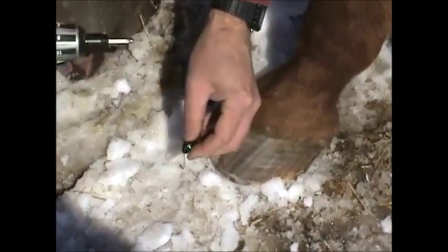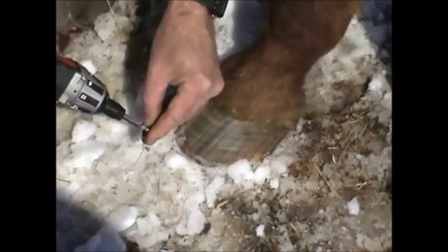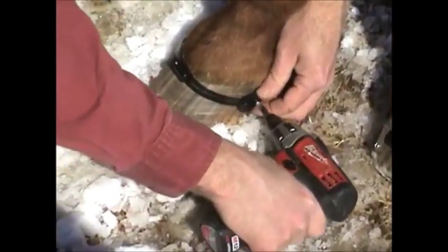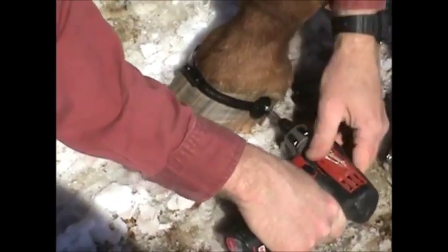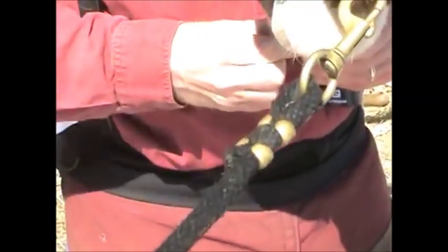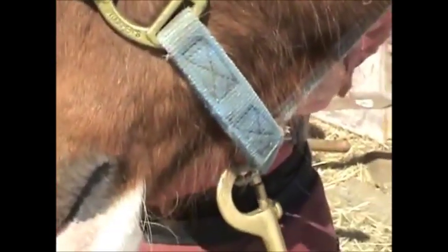Once you get the first two screws in, it goes a lot better. We'll sink this one and then do the placement, push it down where we want it, put the band on. Before they tighten — as the foot grows, it tightens itself. And these you tighten immediately on the spot. There's no shoeing required, so there's no pain involved.